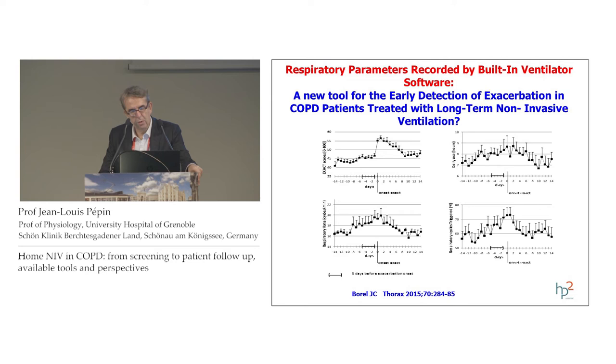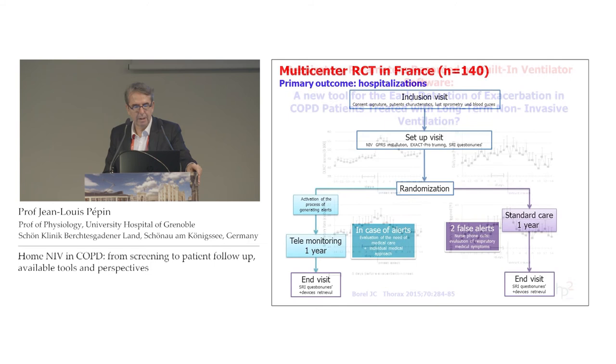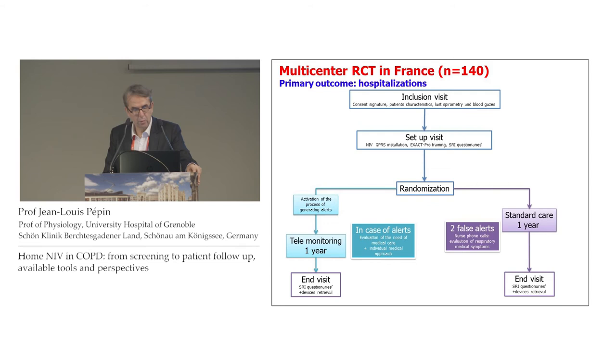You can see that for the mean group, there was a progressive increase in respiratory rate, some variation in daily use of the NIV, and also, interestingly, an increase in the number of respiratory cycles triggered by the patient. So there is a potential to use the monitoring by the NIV device in a telemedicine platform to predict exacerbation. And actually, we are on the way to conduct a randomized controlled trial using this detection from the non-invasive ventilation with some false alerts in the standard care, and telemonitoring in the intervention arm, and look at the cost effectiveness and the possibility to reduce the length of stay in case of exacerbation.